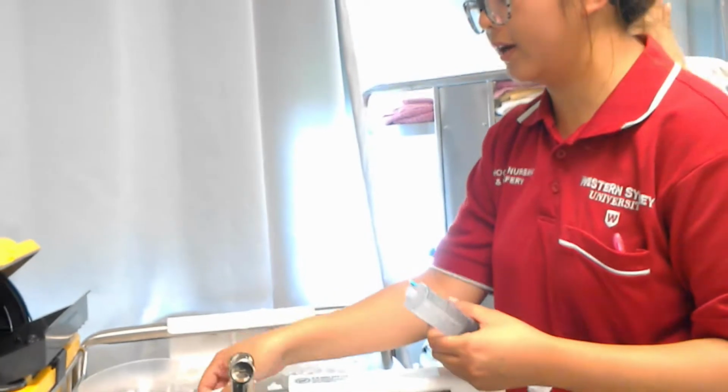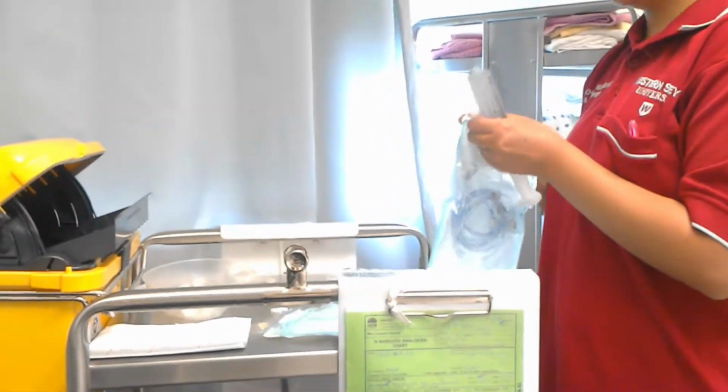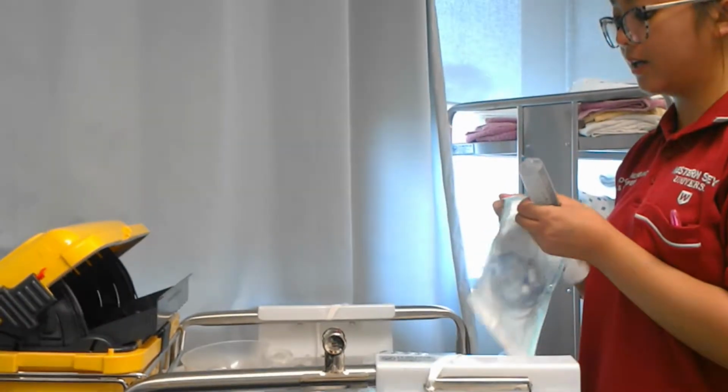I'll just prime the line now. So prior to this, I would have sanitized my hands already.